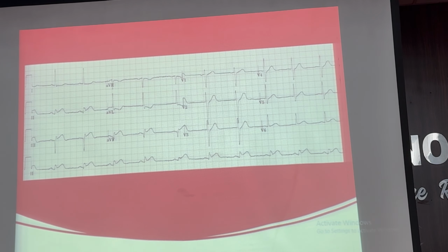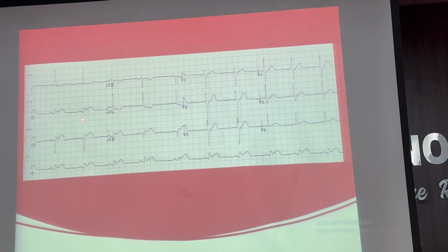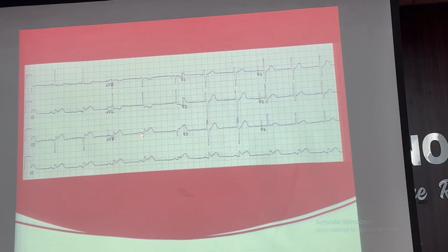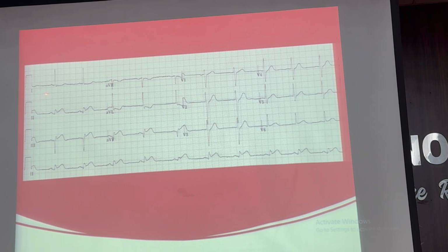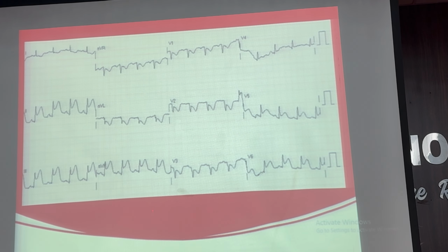Right, so we'll move on to the ECGs. So again, a straightforward ECG with ST elevations in inferior leads. If you carefully look at lead 1 and aVL, you can see the so-called reciprocal changes, right? So this is extending now.